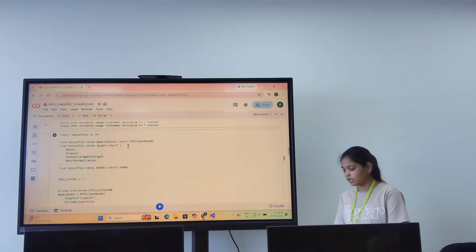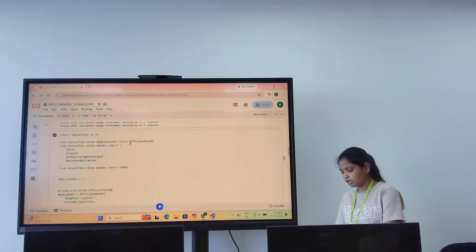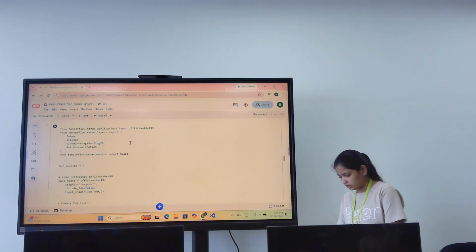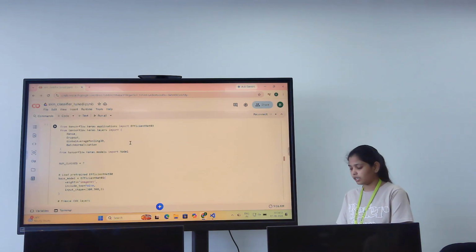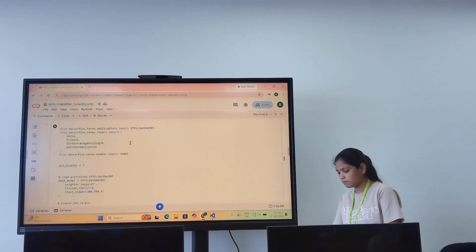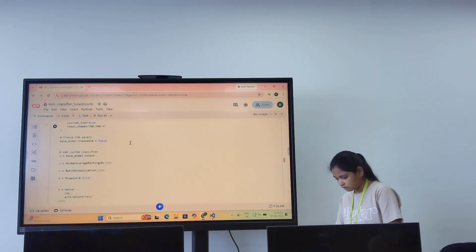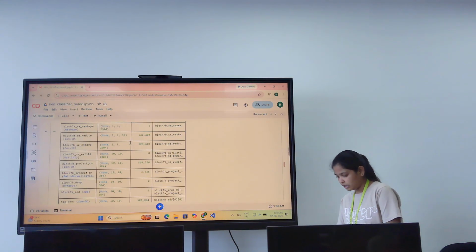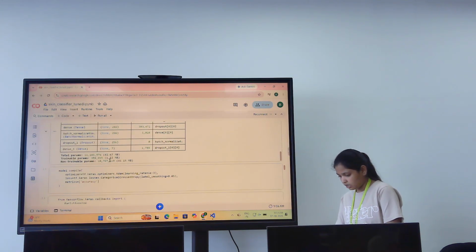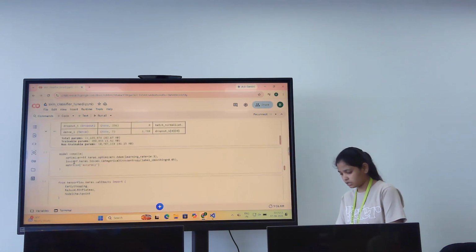And I use a pre-trained CNN model, EfficientNet B3. Instead of training the model from scratch using a CNN, I use the pre-trained model because it gives a good balance between model capacity and computational efficiency. Here we can see the model summary: total parameters, trainable parameters, and non-trainable parameters.